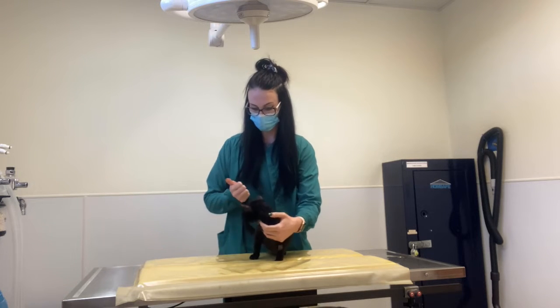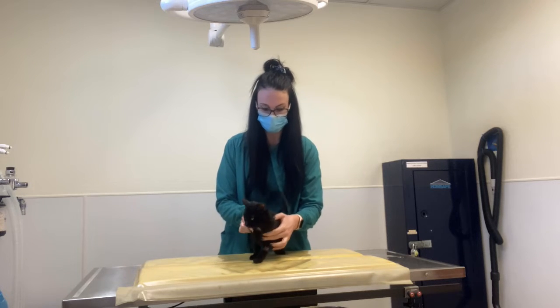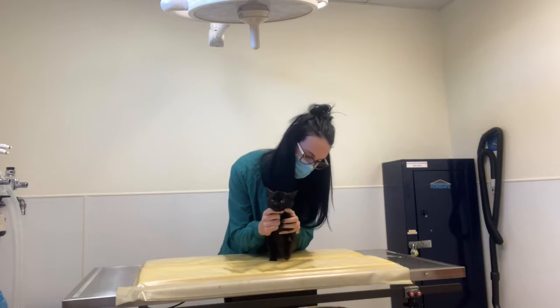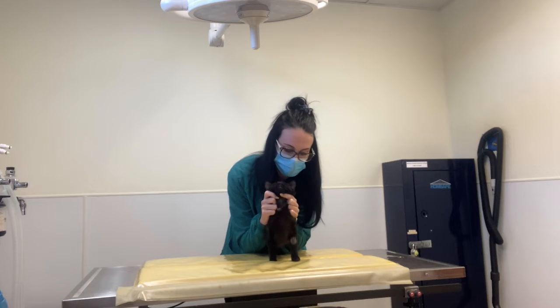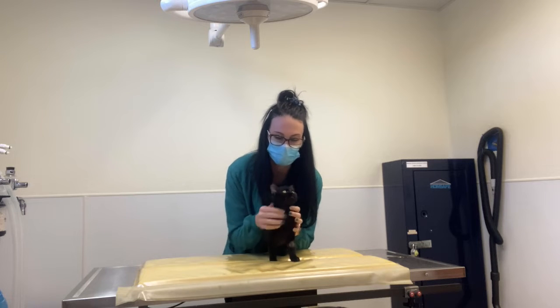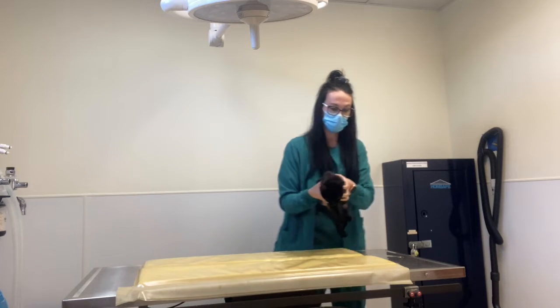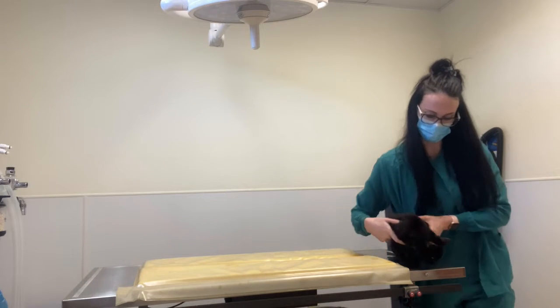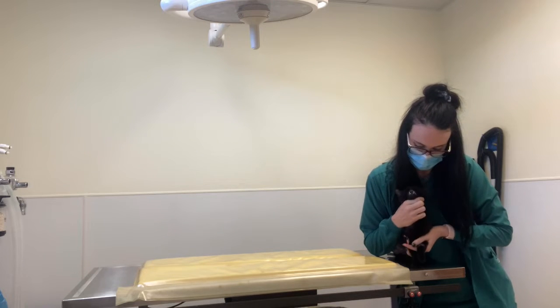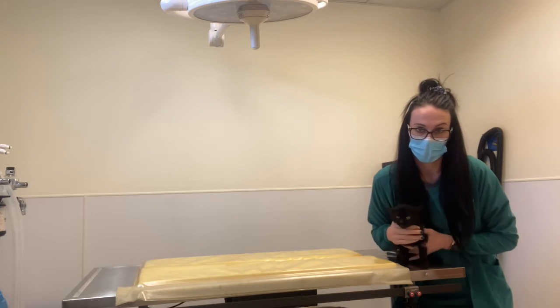So for cats, for a jugular blood draw, you can do it 1 of 2 ways. If she wants to play, then we can just do one of these things and get my hands out of the way, and my other tech can draw. Or with cats, sometimes they want to kind of bat at whoever is drawing blood. So for that, we would hold her like this with her head up, and then I'd grab her feet like this, and then the other technician could draw that way.